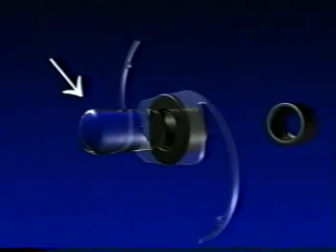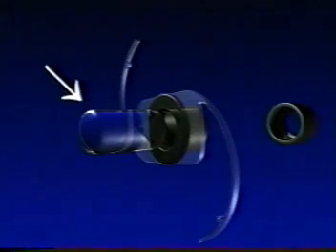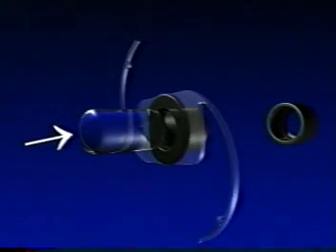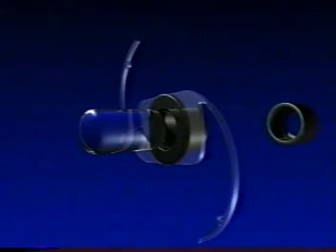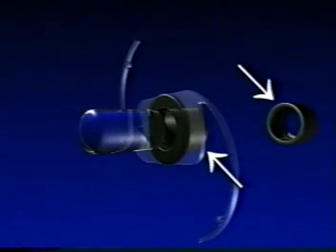The implantable miniaturized telescope is composed of two parts. First, the optical cylinder is made of pure silica glass and contains two lenses, an anterior positive lens and a posterior negative lens. The second one is a device with a darkened central halo to prevent glare.